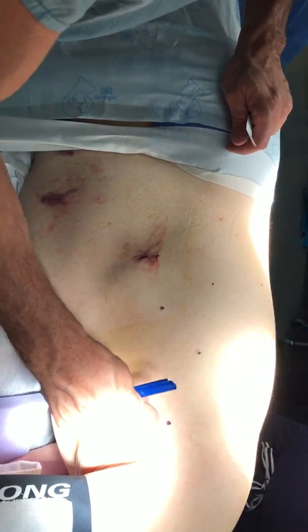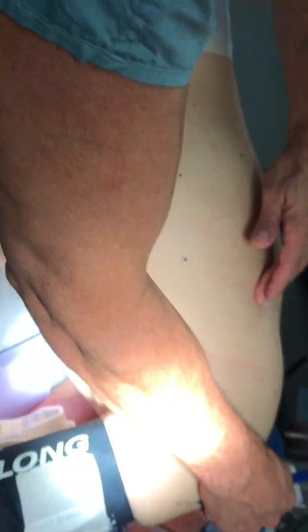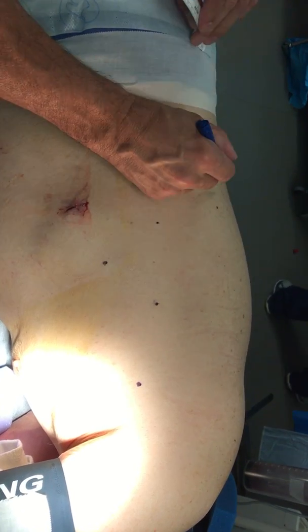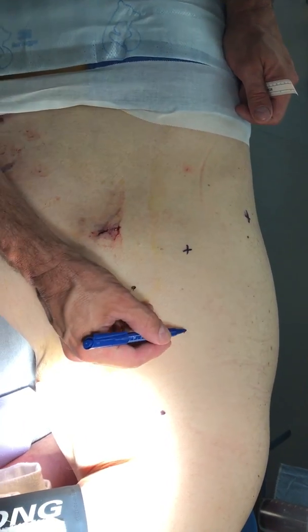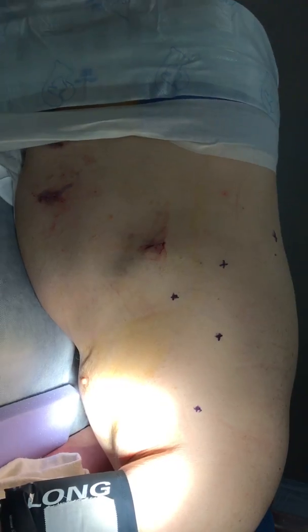Now, camera, robotic arm one, robotic arm two, access. And then this one — here is the tip of the scapula. This comes straight down, and you want one probably right about there. And that's where your fourth arm goes. So that's where they'll probably go, something like this. Roughly.